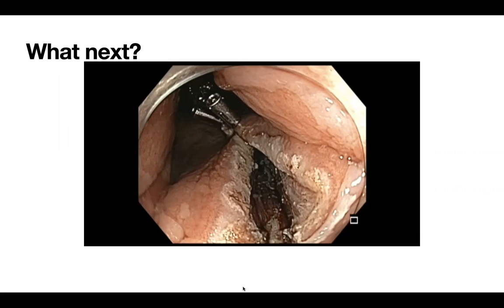I think some of the reason why Raju had a harder time to capture the mucosa is that, I don't know, did he have a new technician helping him? Because the snare was open too much. When you open the snare, you shouldn't see any of the straight wires coming out from the plastic.